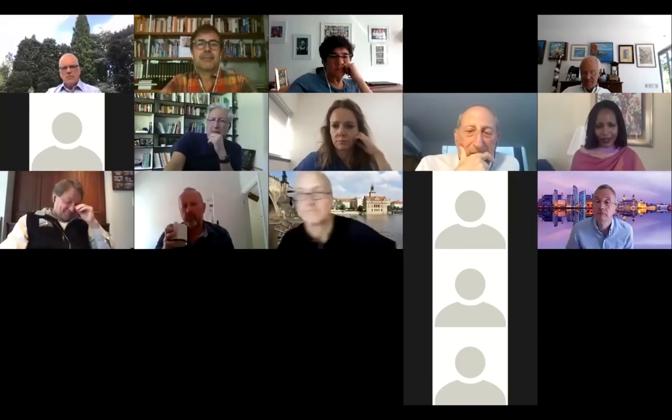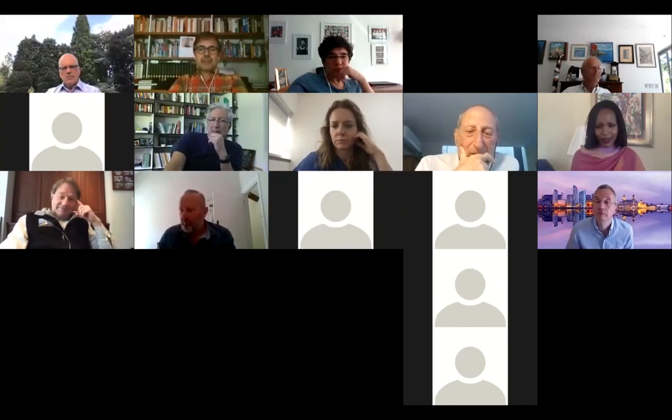Rasha, you want to know about the measurement of micrognathia? Differentiating between a micrognathia and a retrognathia? Not very well. And I must say that I've always thought of myself as a dysmorphologist.